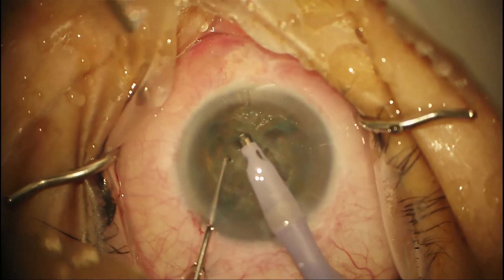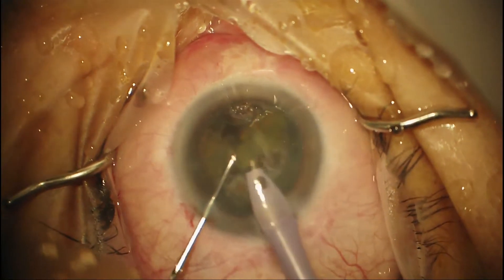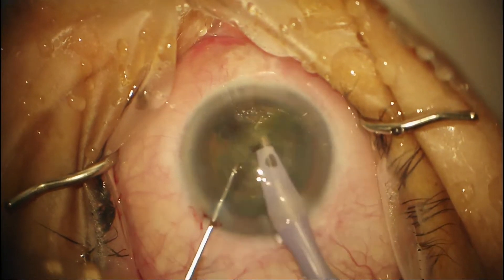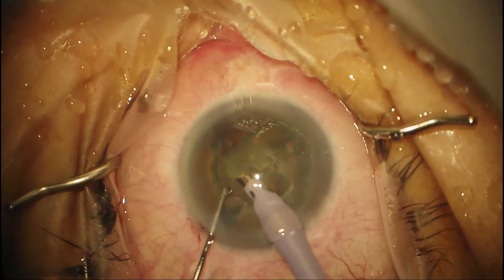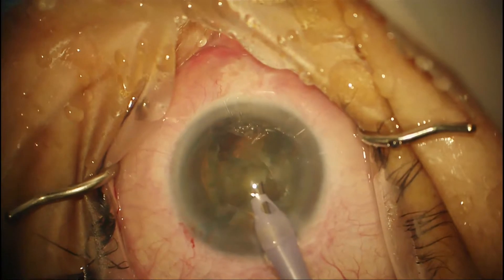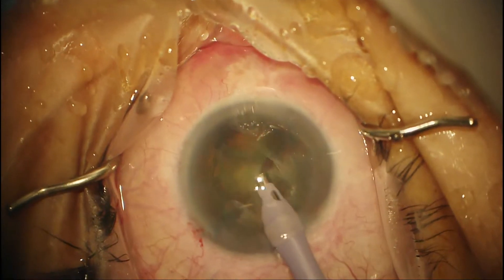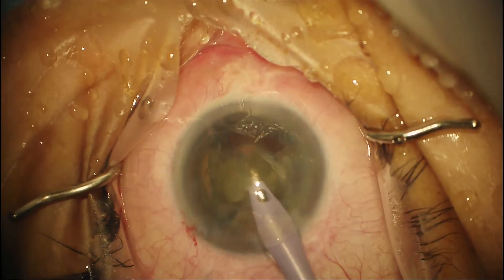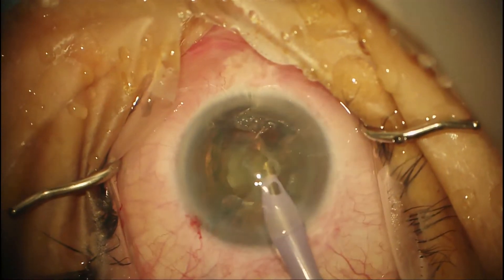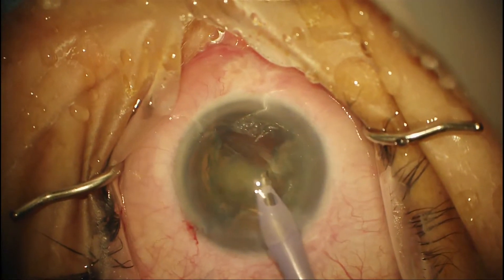Now we moved over to quadrant mode, which is obviously more vacuum, and we're going to bring the quadrants. The iris plane is always the key reference point — you want to be outside the bag in the iris plane. I removed my second instrument; oftentimes that stabilizes the chamber more because there's no fluid egress from the paracentesis. On quadrant mode, minimal manipulation of the phaco tip is needed, especially on newer machines — the nucleus just bounces and dances on the tip. You don't want to be up by the endothelium and you don't want to be in the bag, to avoid any surge or nicking the capsule.